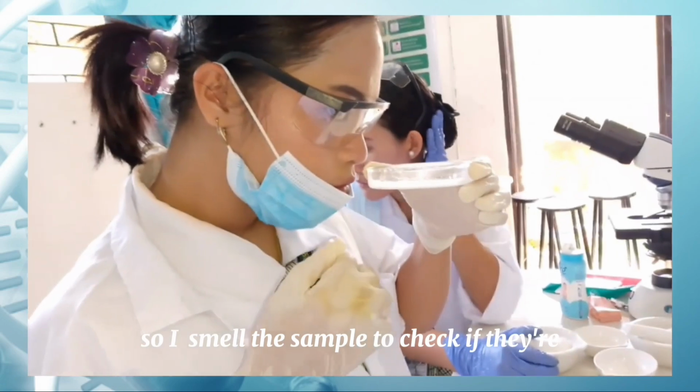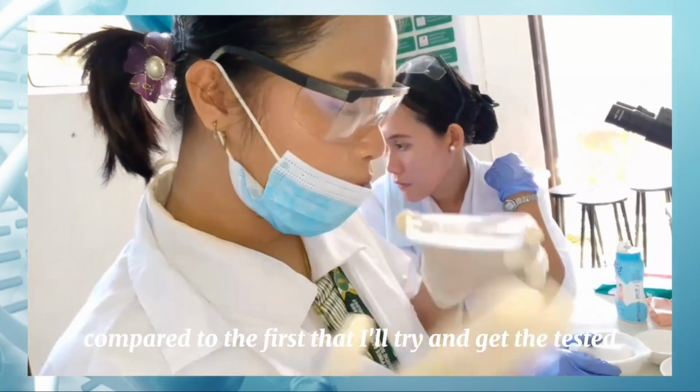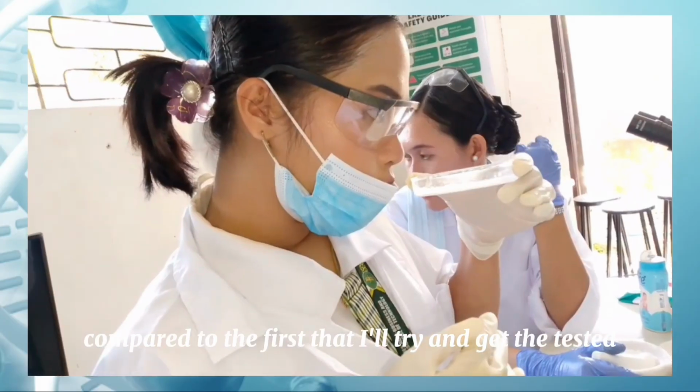We also smelled the sample to check if there was a difference in odor compared to the first adulterant that we tested.